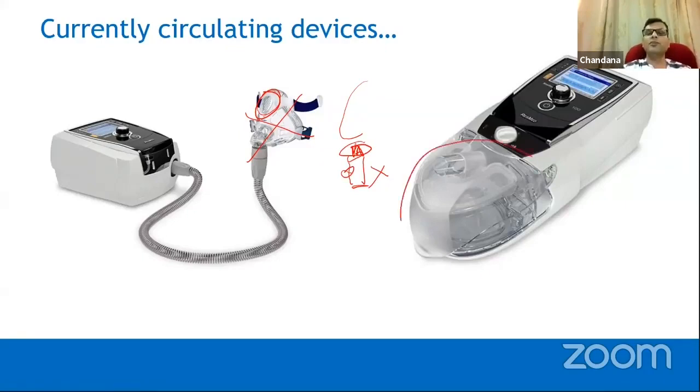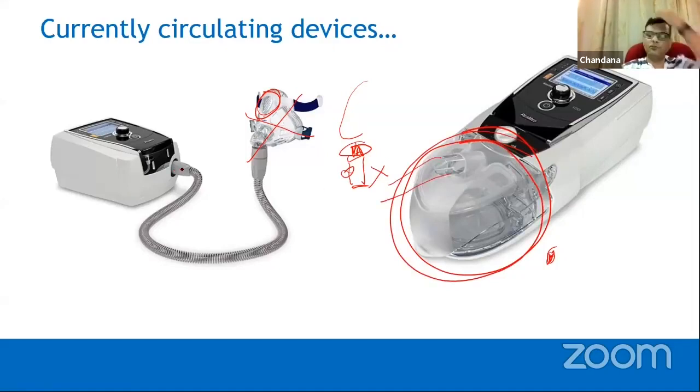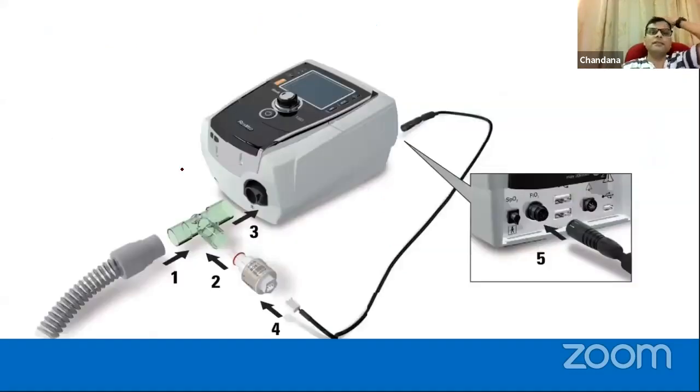You can attach a humidifier if you want, but generally humidifiers are not that required, because you are not bypassing your humidification system in the throat and mouth, but it's quite drying. So it will help in the long run. For a shorter NIV, generally you don't need humidification, but for longer NIV, days and days, it's ideal if you can have a humidifier attached. You attach the tubing over here when you attach a humidifier to the ResMed one.